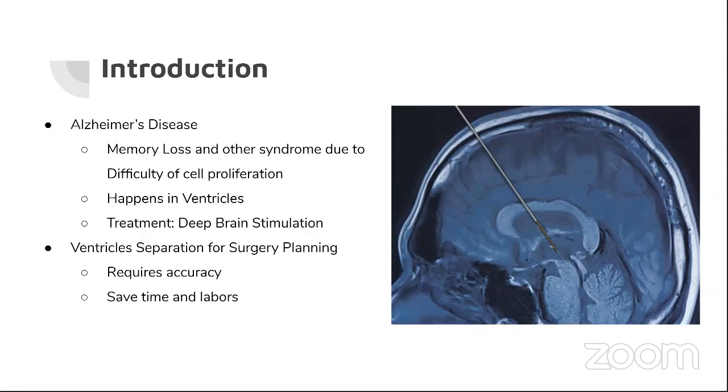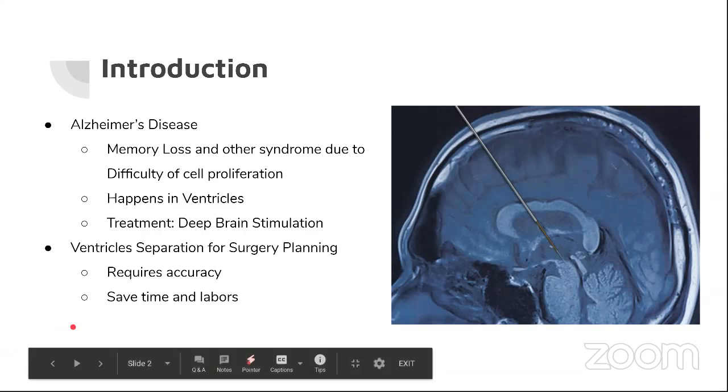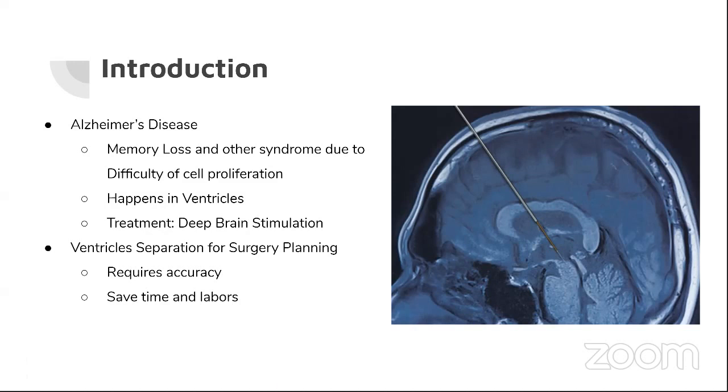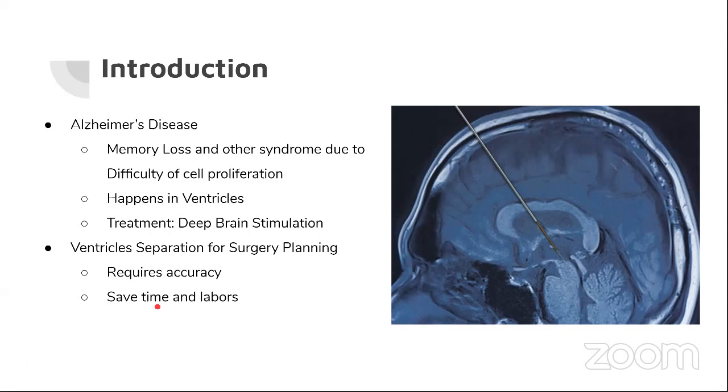So we are seeking a 3D image segmentation model that could let the computer itself separate out the ventricles for us. And hopefully it could save time and labor and could help with further surgery planning. Next I'll let my group member Wanchen talk more about the applications.